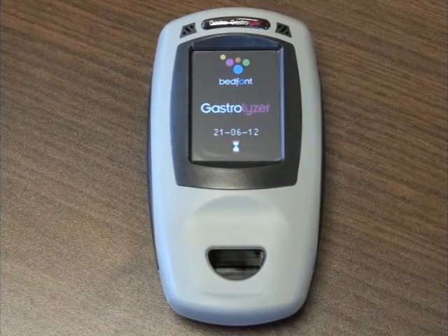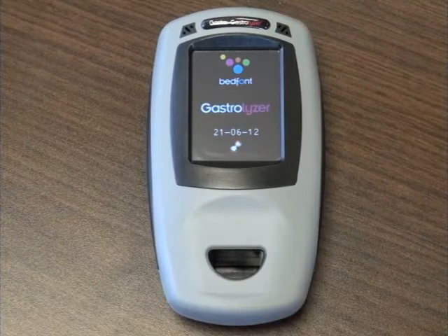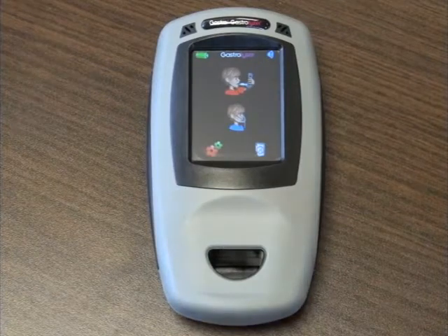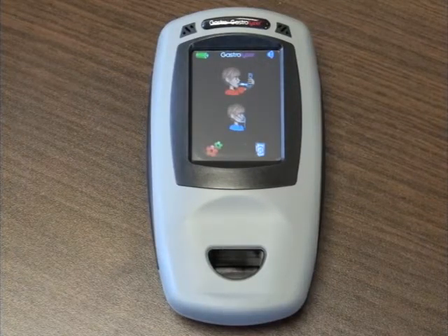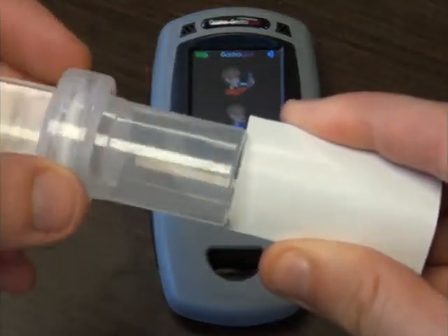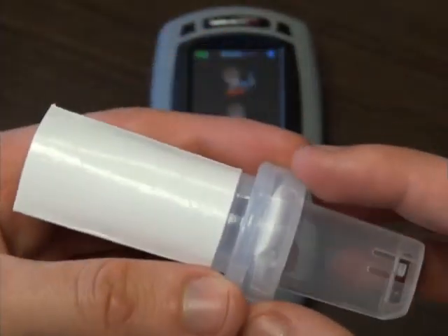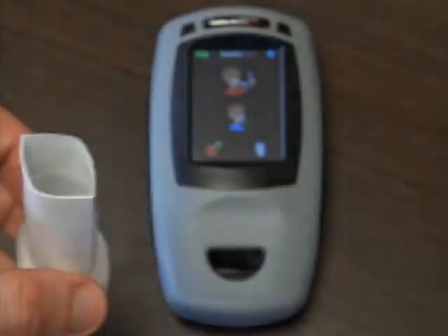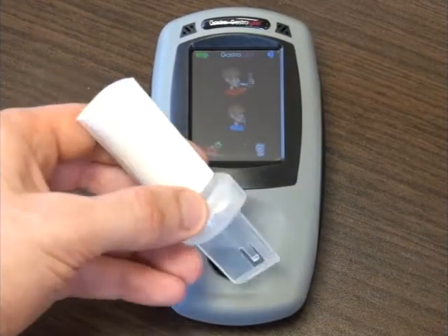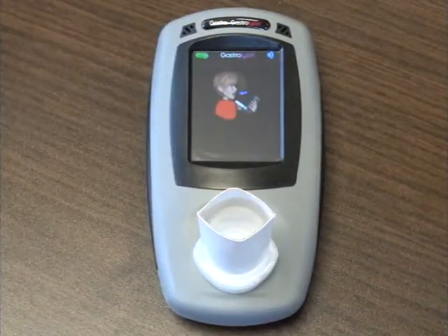The Gastrolyzer will take a few moments to zero. From the main menu, select the correct test you wish to make, depending on whether you are using a face mask or a mouthpiece.